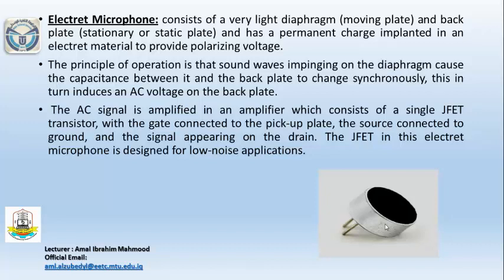The AC signal is amplified in an amplifier which consists of a single JFET transistor with the gate connected to the pickup plate, the source connected to the ground, and the signal appearing at the drain. The JFET in the electret microphone is designed for low noise application.